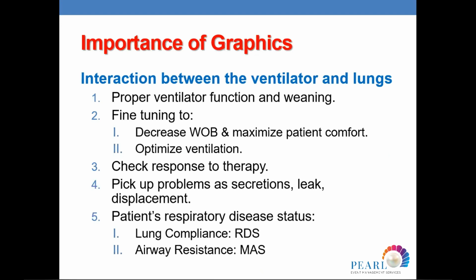So why do we need the graphics? Before, we were just putting the patient on the ventilator and checking the blood gas and the X-ray, and we don't know what's going on. But with the graphics, you know what's going on interactively between the ventilation and the lungs. And this will help us a lot. Why? Because we can properly know the ventilator function, and we can wean. We can fine tune to decrease the work of breathing and maximize the patient comfort.